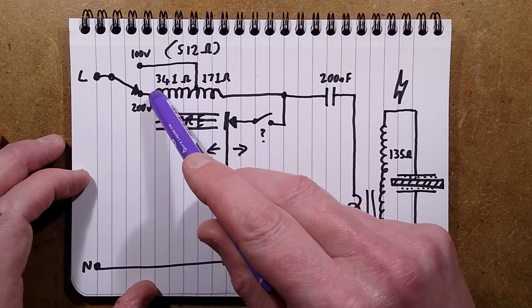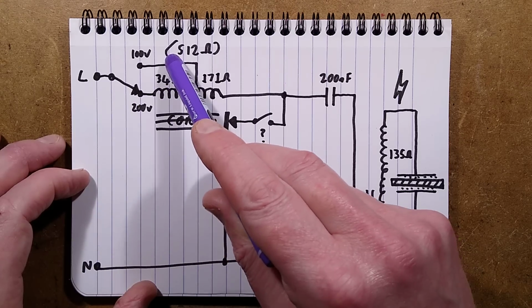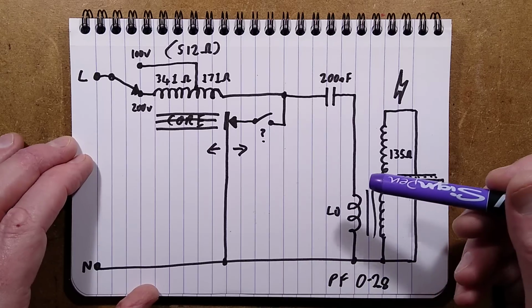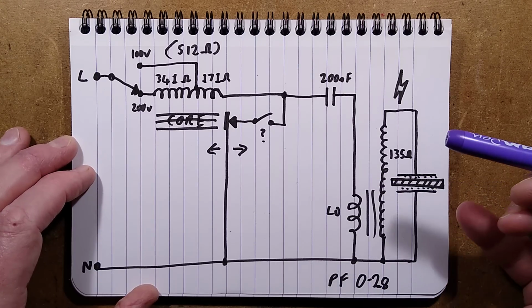But there's another section, 341 ohm, that gives a total, when set to the 200 volt setting, of 512 ohms, which is quite high. I did measure the power factor. It's 0.28. Well, great power factor. What do you expect?